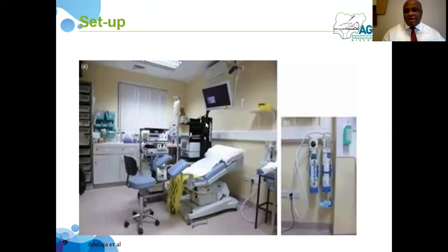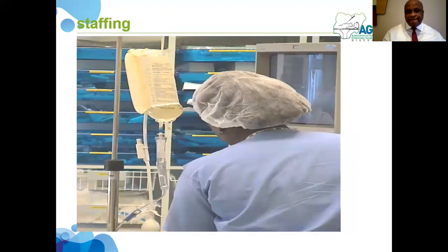This is what your typical outpatient hysteroscopy setting looks like. Comfortable trolley, comfortable stirrups, a chair for the surgeon, your monitor, and if you're feeling rich, a second monitor here for the patient to follow what you are doing.